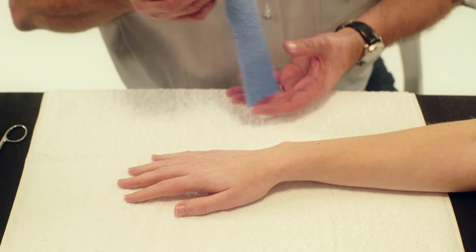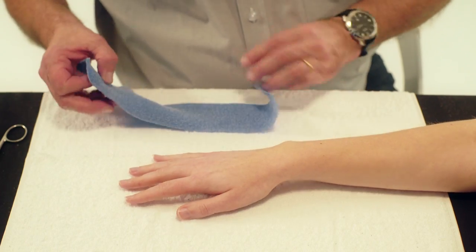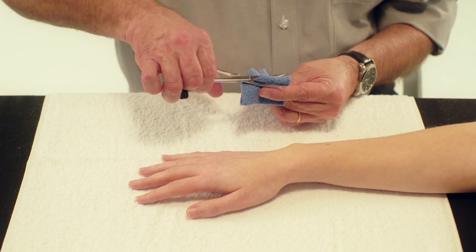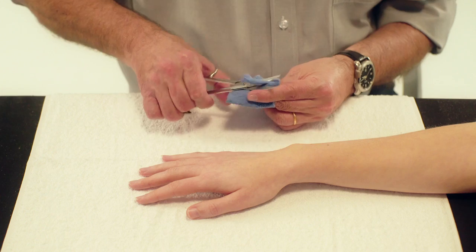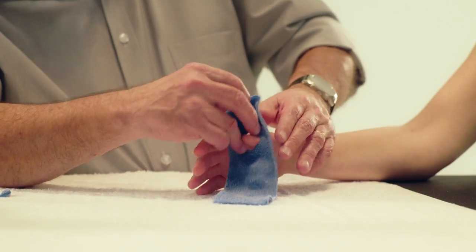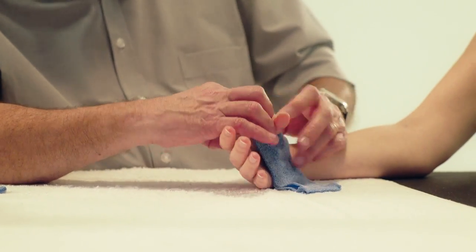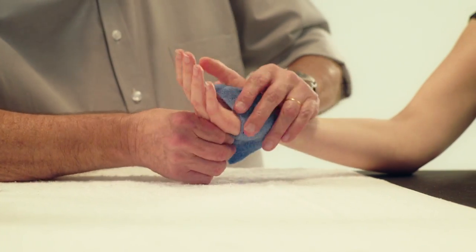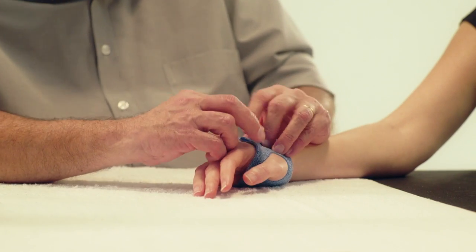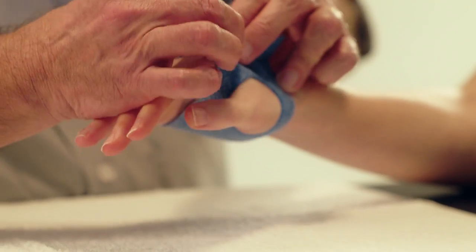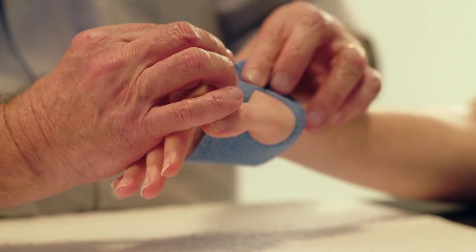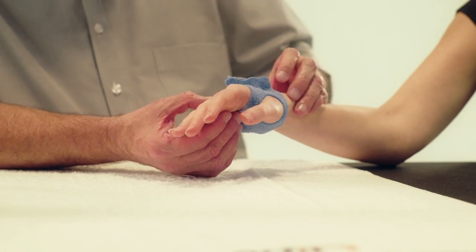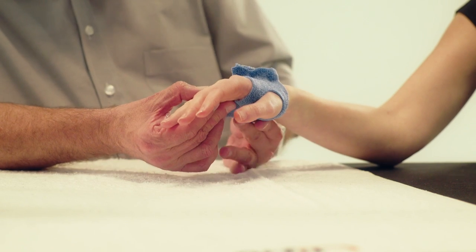Heat to activate the Orphicast. Fold the first strip of Orphicast in half widthwise and cut a hole for the thumb at about three quarters of the length. Slide the thumb through the hole with the larger portion of the strip placed on the palmar surface of the hand. Pinch the two ends of the Orphicast together on the dorsal part of the hand.